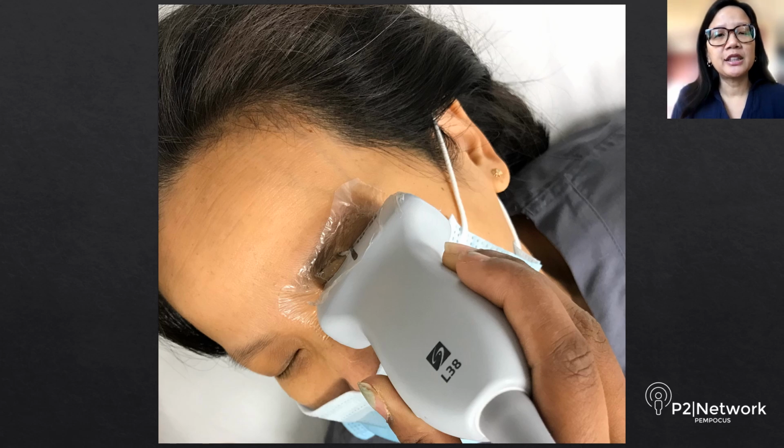So you can perform ocular ultrasound in either a transverse plane with the probe marker pointing towards the patient's right, or a sagittal plane with the probe marker pointing towards the patient's head. There's also a way to get a coronal view, though this can be a bit more challenging, and I won't discuss that during this lecture.